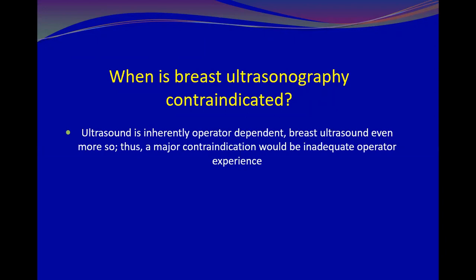Ultrasound is inherently operator dependent, and breast ultrasound even more so. Thus, a major contraindication would be inadequate operator experience. This is the contraindication for breast ultrasound. You got it? Inadequate operator experience. This is the only contraindication for breast ultrasound.